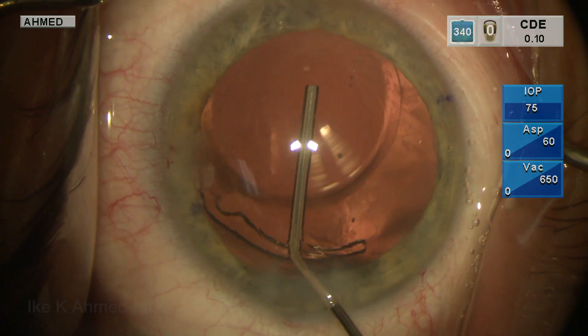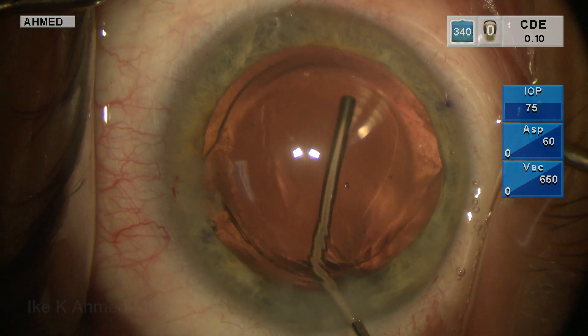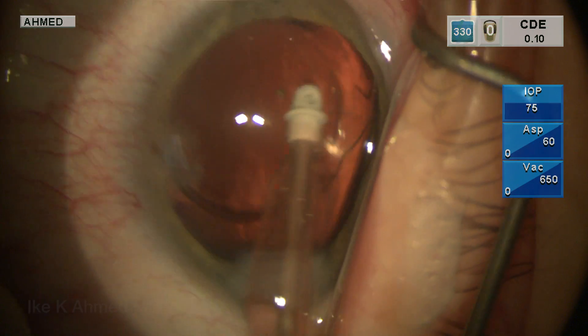The IOL is positioned into the correct alignment, rotated into position here to sit parallel to those marks, and the viscoelastic is removed from behind the lens to ensure and prevent postoperative rotation.